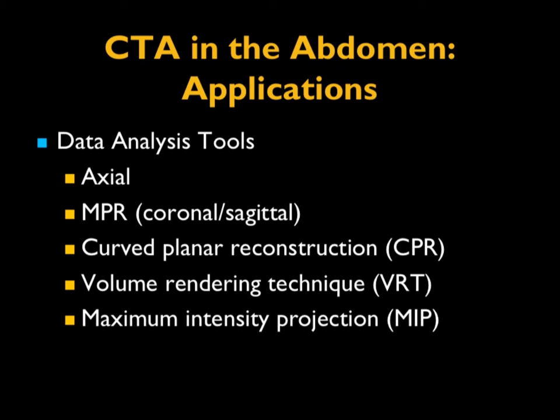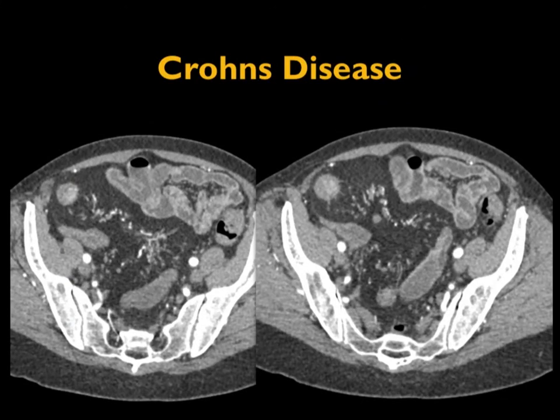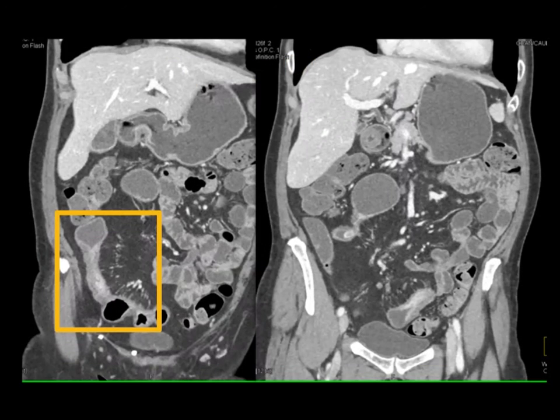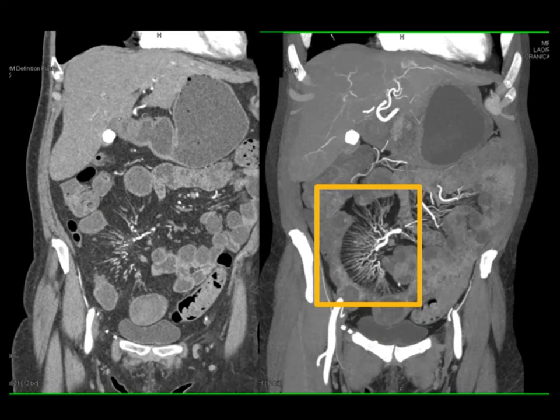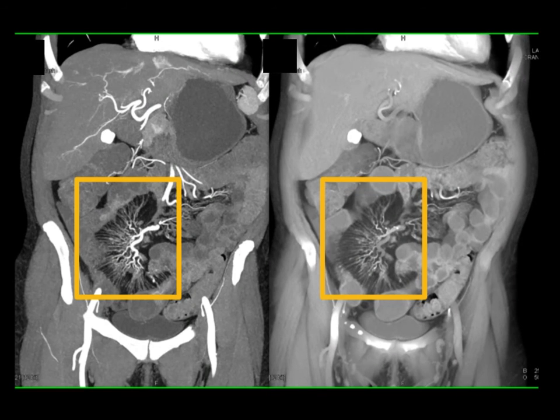Occasionally we use curved planar reconstructions, though not very commonly in routine abdomen work. We tend to like volume rendering, but volume rendering and MIP are both used in image analysis. Here's a patient with Crohn's disease — you see thickened small bowel, thickened right colon, some prominent vessels. But in the coronal view, you really understand the extent of involvement from the terminal ileum to cecum, the areas of stricture. With MIP you see the prominent vasa recta, the so-called comb sign, indicating active disease requiring aggressive treatment. Going from volume rendering to MIP together, you recognize the amount of information gained by supplementing routine axial images with coronal, sagittal, and 3D imaging.